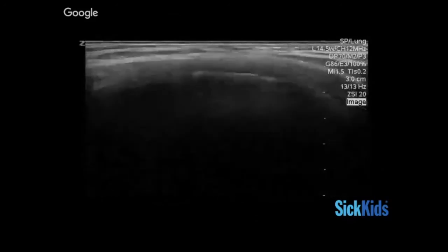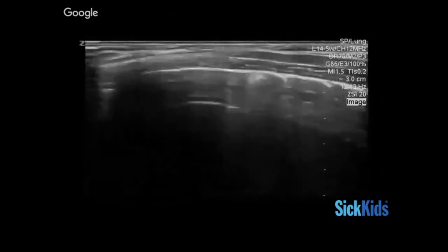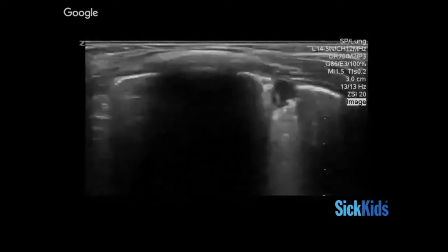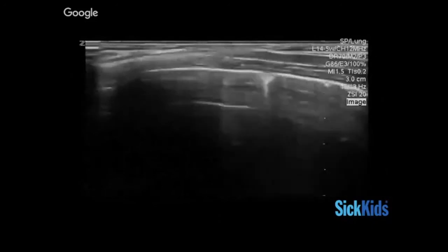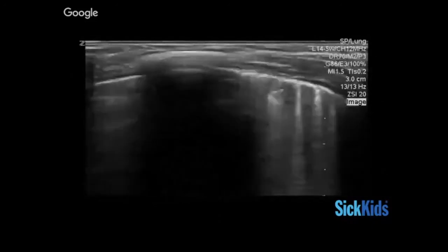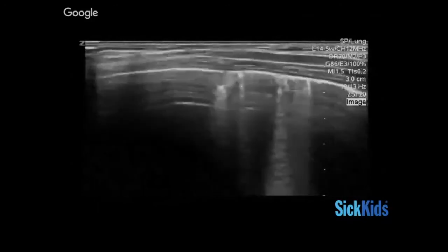where you see a bit more focal B lines. So a little bit more suspicious, and you look around a bit more. And when you follow it, you definitely see more abnormalities later on. So you kind of see the lesion that's becoming almost 1 centimeter with the shredding and the B lines underneath the irregular border.